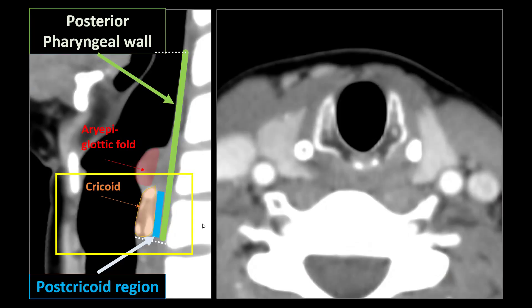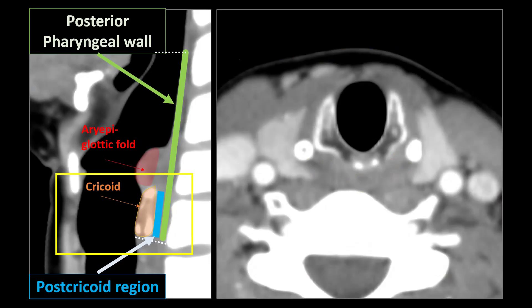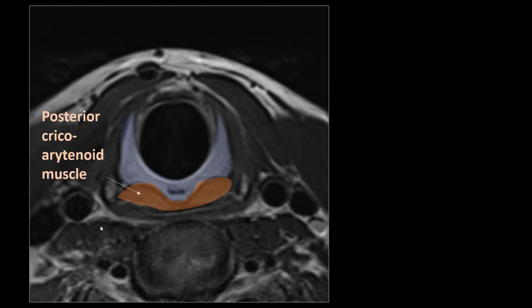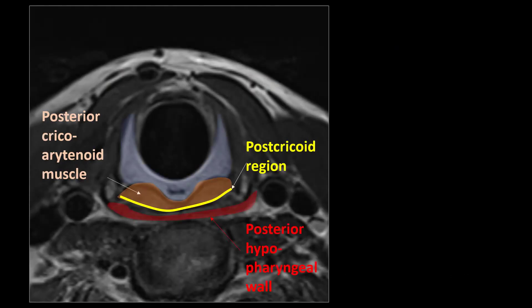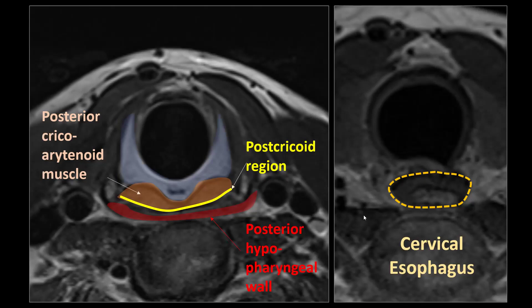On a magnified axial image, we can see the cricoid and the posterior pharyngeal wall. The anterior mucosa posteriorly of the cricoid is the post-cricoid region. The mucosa of the post-cricoid region and the posterior hypopharyngeal wall lie immediately on top of each other, so we can't really see the difference between the two even on high-resolution MRI. A very high-resolution image shows the cricoid, the posterior cricoid-arytenoid muscle, and then a very thin line of mucosa — that's the post-cricoid region. Scrolling down we reach the cervical esophagus.